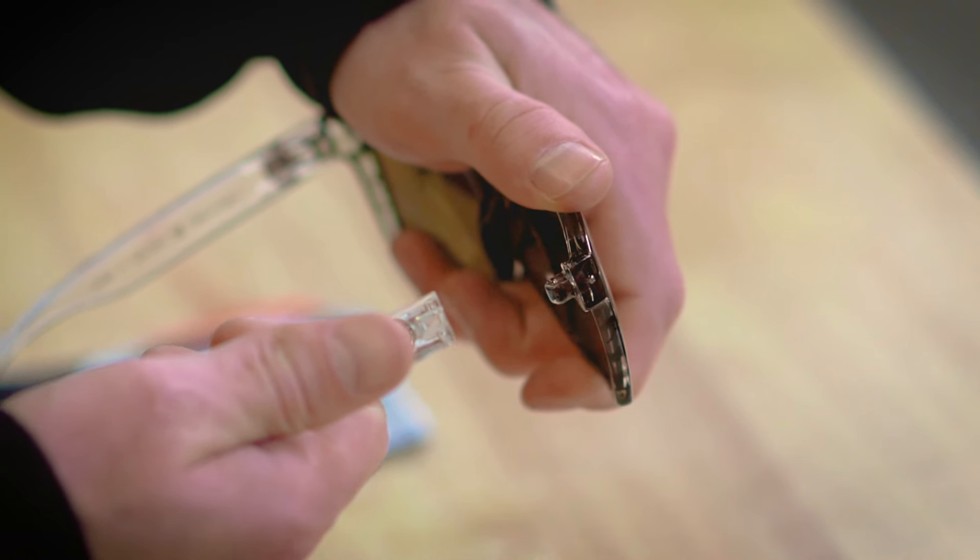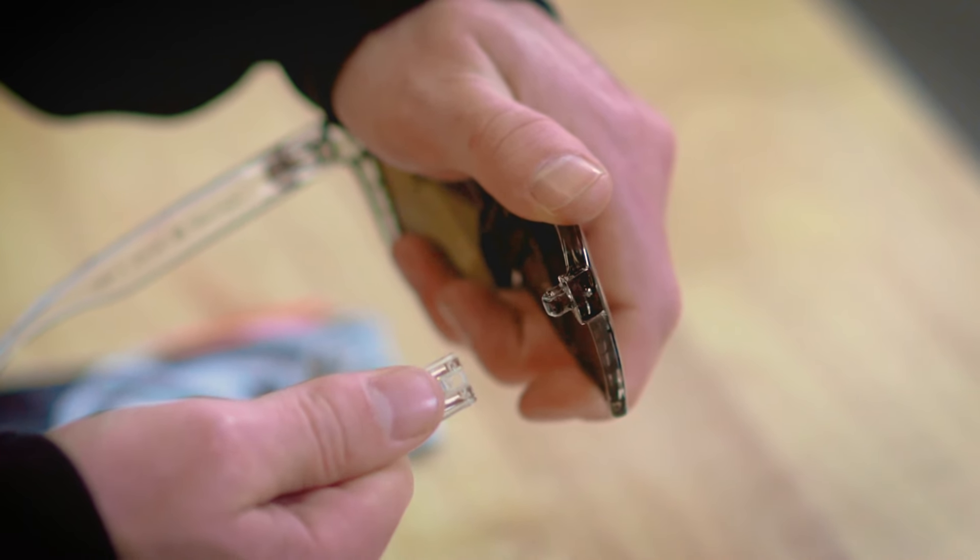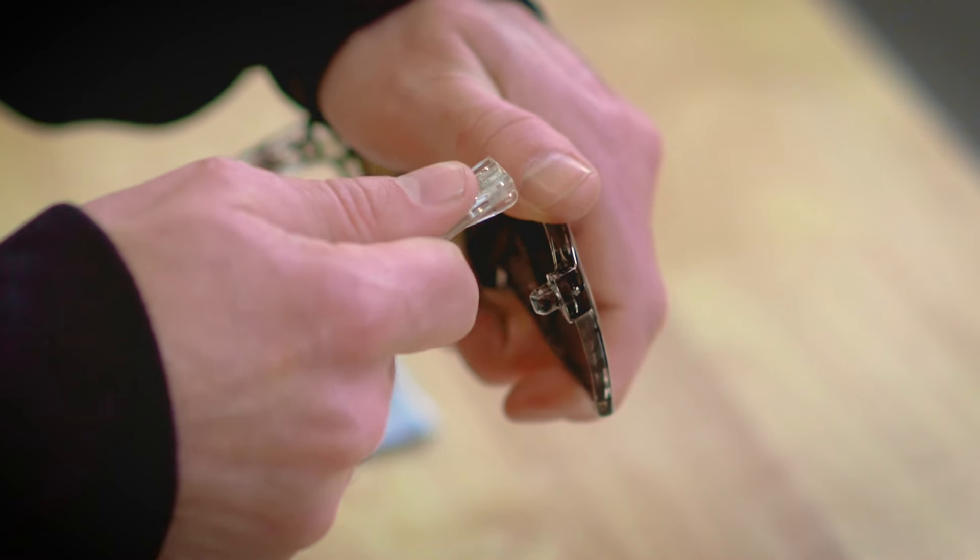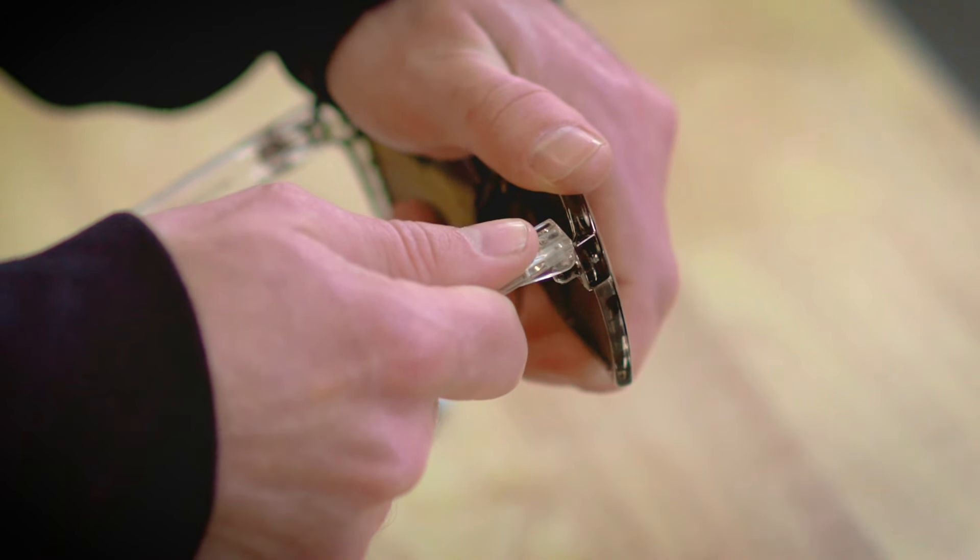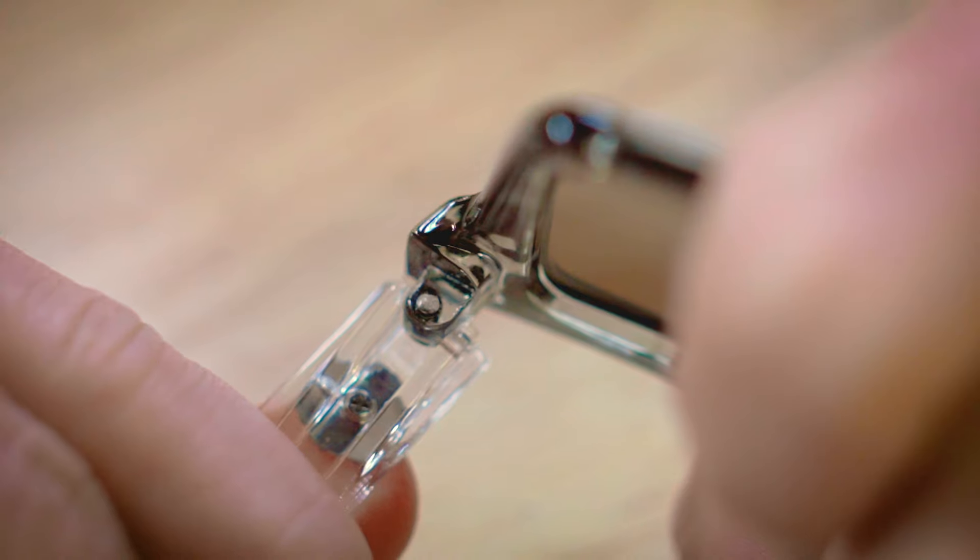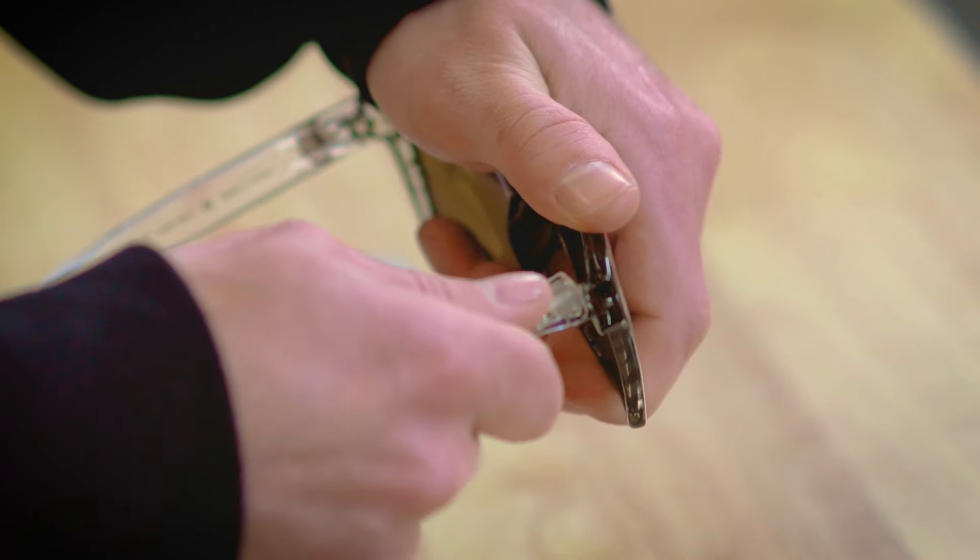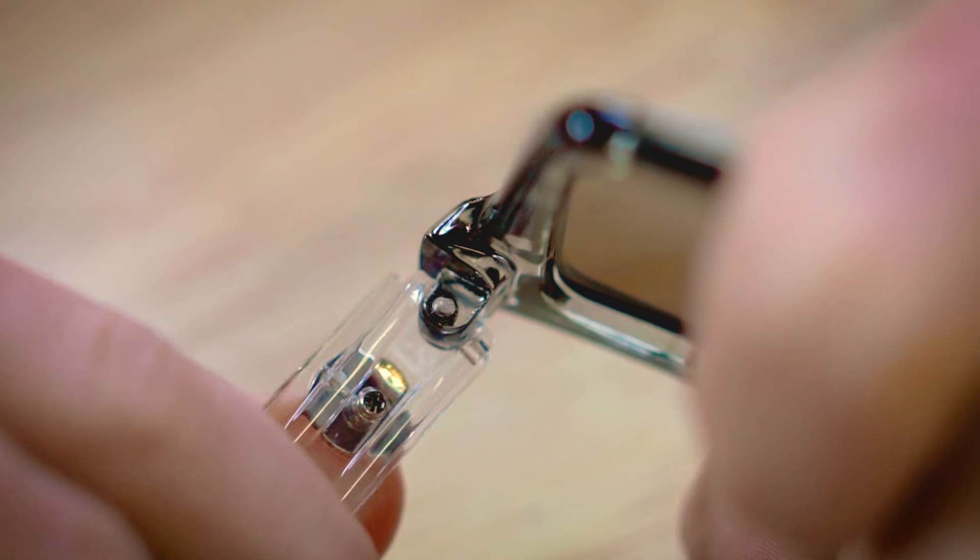Now attaching the arm back on, hold the frame in the same manner. Hold the arm with your thumb over the emblem again. Get the channels of the arm into the post of the frame and press down. Then press down and rotate the arm, and it'll pop in just like that.